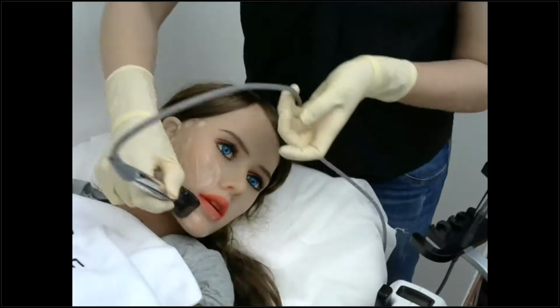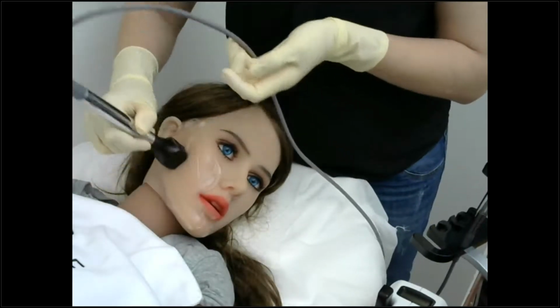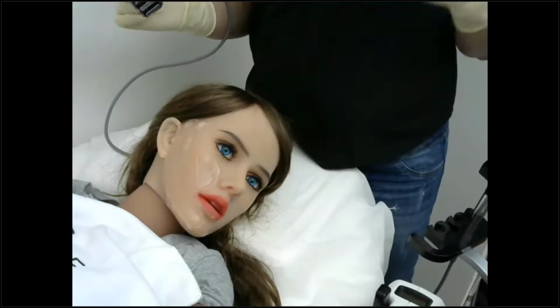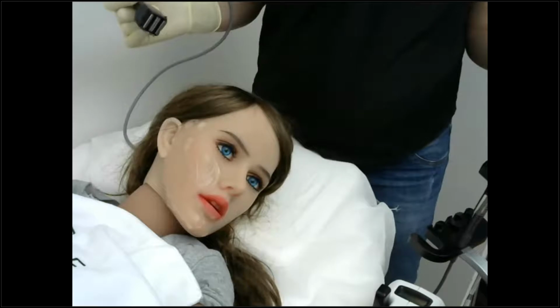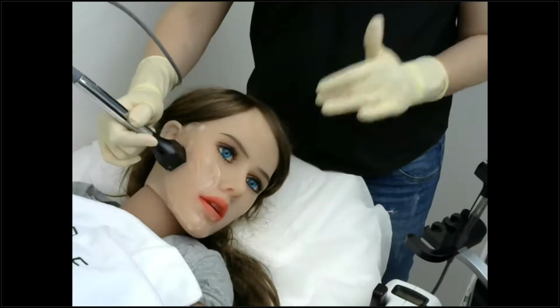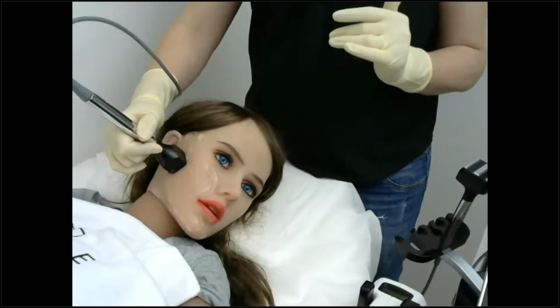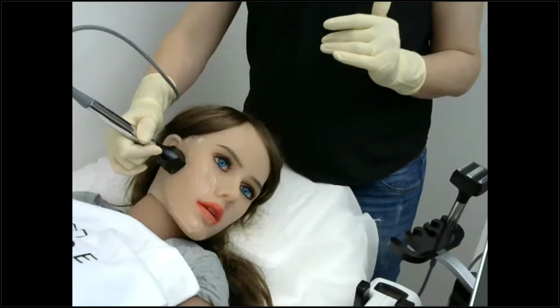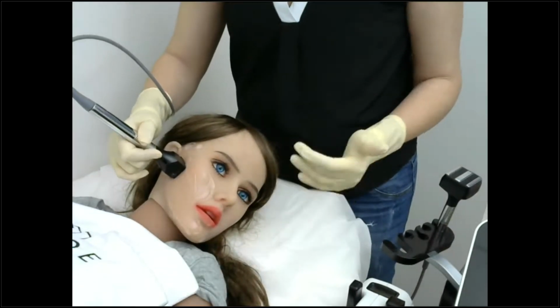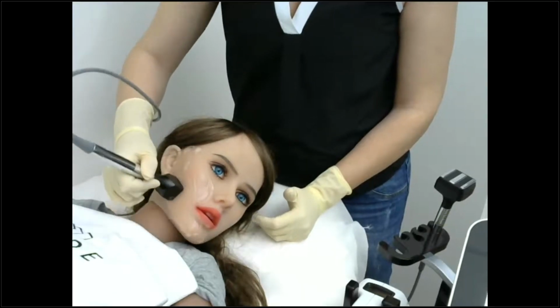So once I have good and easy access for the movements on my patient's skin, I can press ready and start the treatment. In order to start the treatment, I always have my applicator on the face. Once I press the foot switch, the pedal, then RF starts, the system starts to deliver RF. I will not be able to show it now.